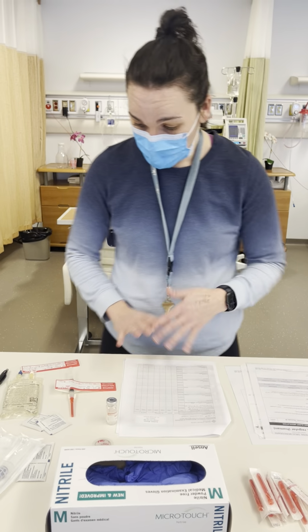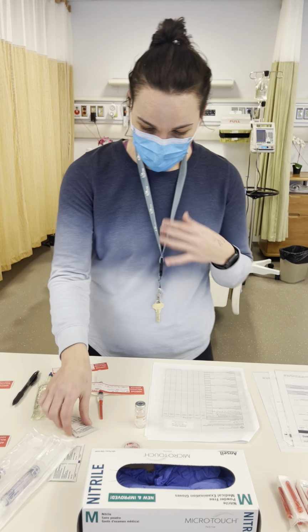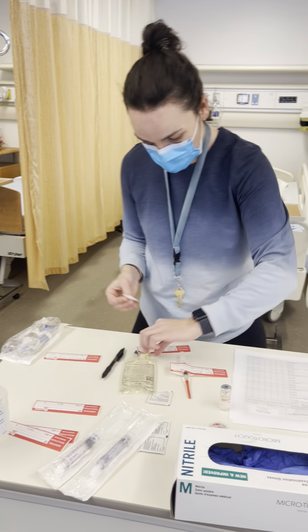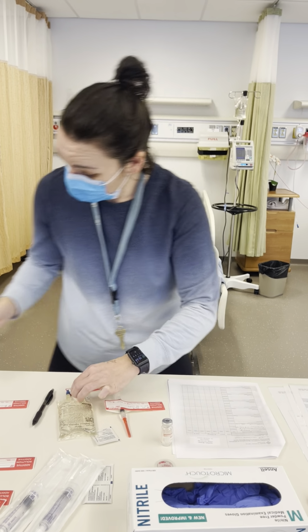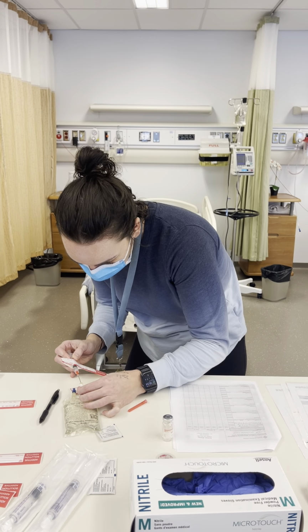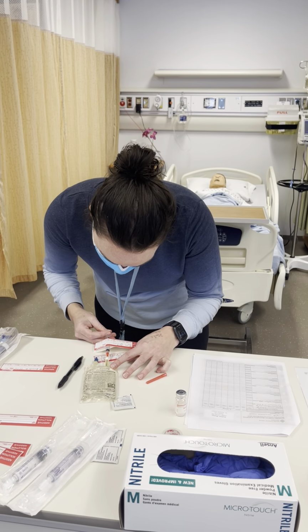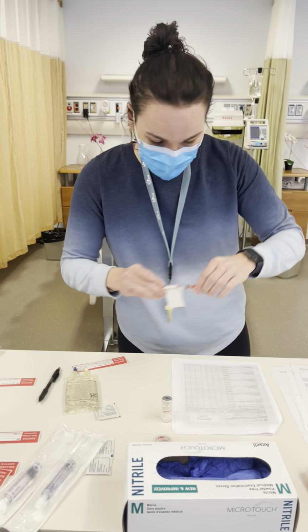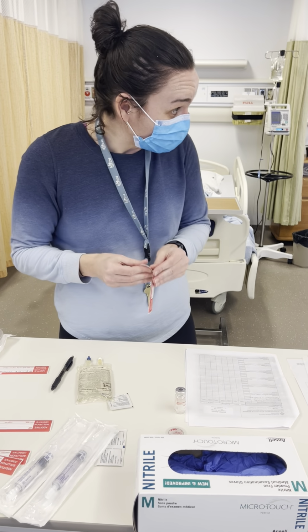So everything's good. We can get a second nurse at this time to come check. And she says this all looks good, so we can put it into our bag. Just clean 30 seconds, let dry. And then we can inject our 1 milliliter of insulin, which is going to be 100 units. And we'll dispose of our syringe, and we'll label it right away.